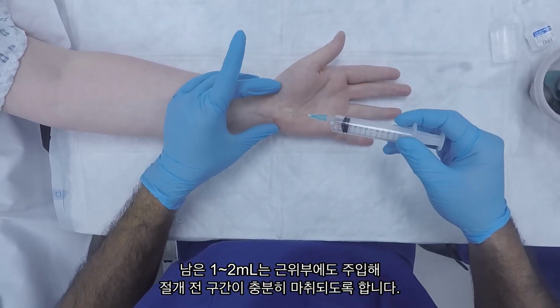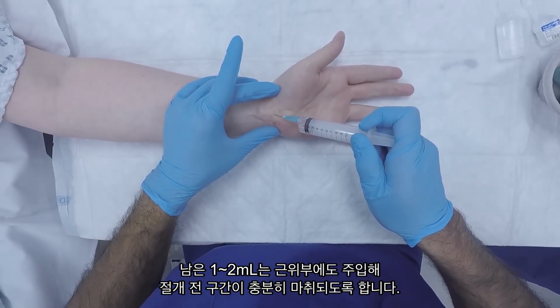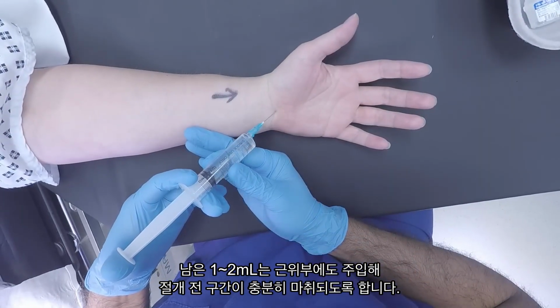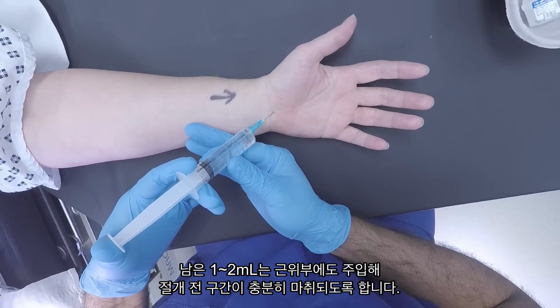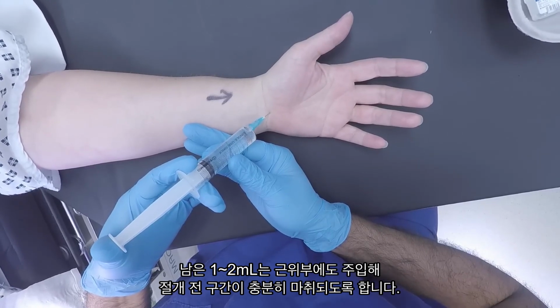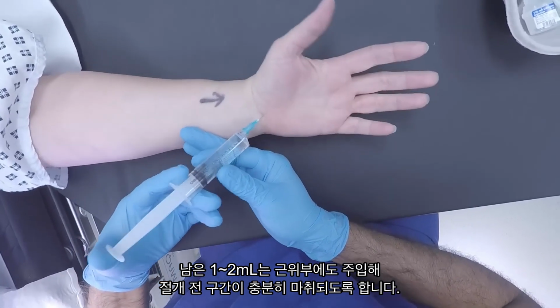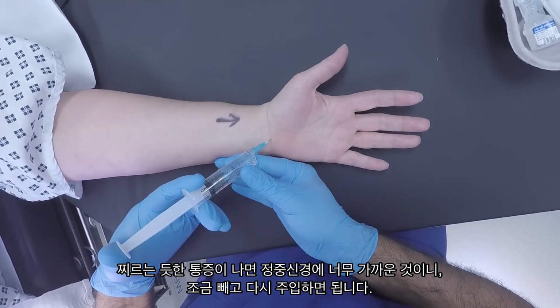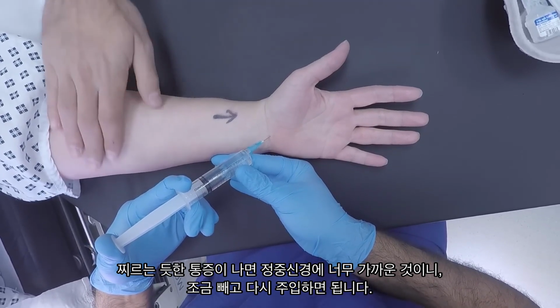With your last mil or two, infiltrate proximally to make sure that the whole of your incision is fully anaesthetized. We can see that pop as we go through the transverse carpal ligament again quite nicely here. Sometimes when you enter the carpal tunnel with your needle and start injecting, the patient will feel a sharp sting. This means that you're a bit too close to the median nerve, so just withdraw slightly and you should be able to infiltrate again without any problems.